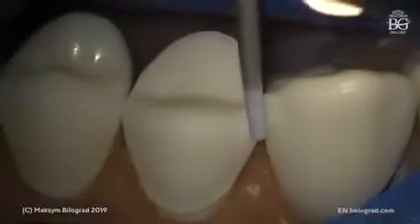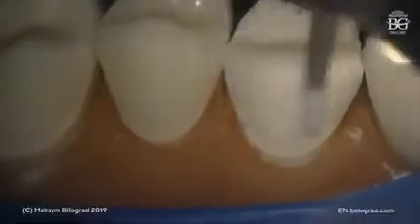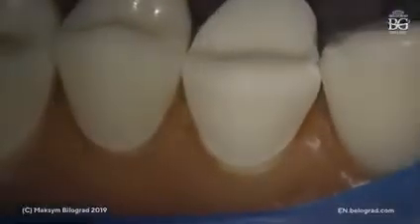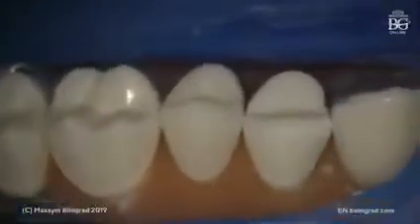Okay, all this outline is pretty nice, pretty visible. It's sharp enough. Okay, here also. Basically, we provided pretty smooth preparation during the previous stages. That's why step number 3 will not take a lot of time. Okay, I think that we are also done with that tooth as well.